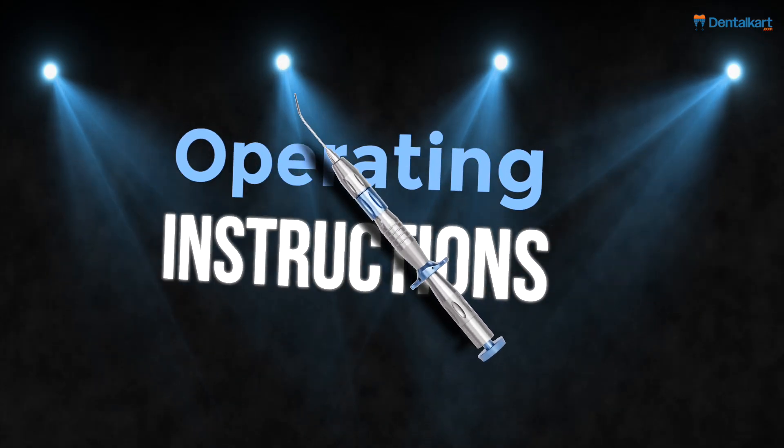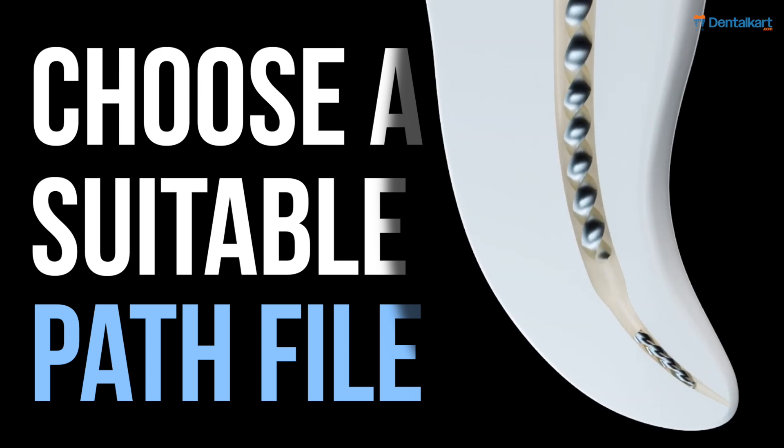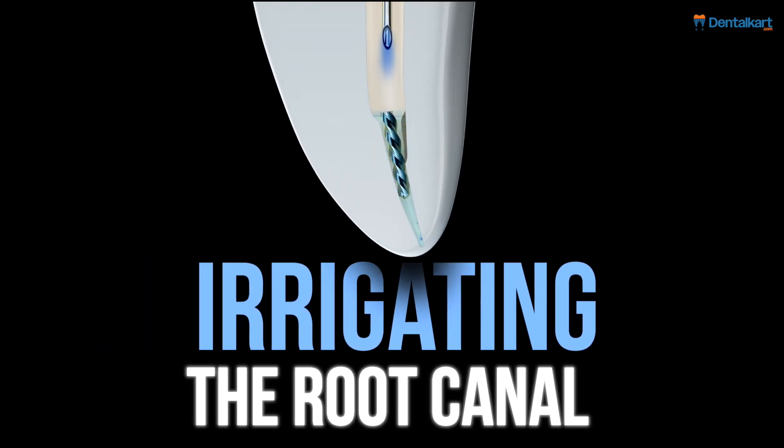Moving on to the operating instructions. Choose a suitable path file and rotate it clockwise at 300 rpm to straighten the coronal curvature of the canal. This will facilitate better access to the broken file. Then irrigate the root canal thoroughly.